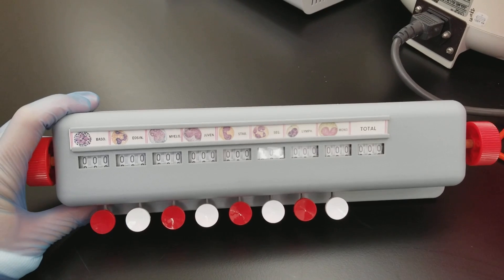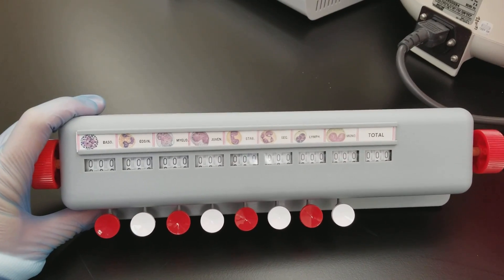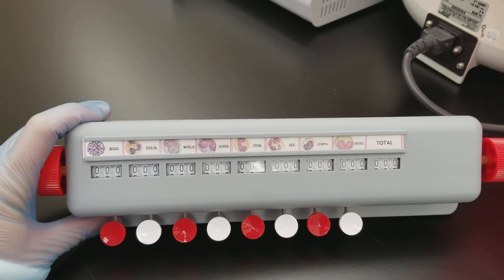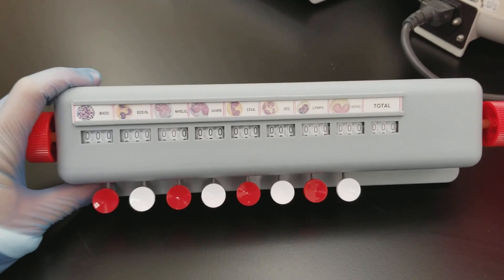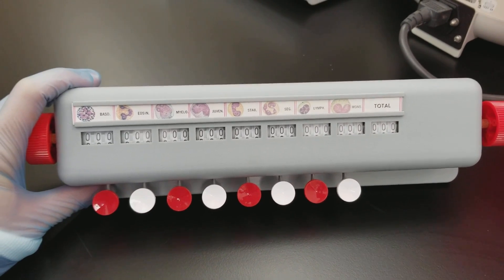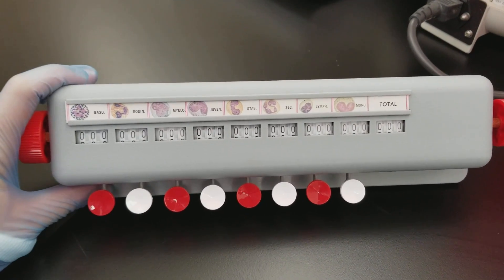You'll be looking at the red cells and the white cells and the platelets to make sure that everything looks pretty much how your CBC printout indicated.